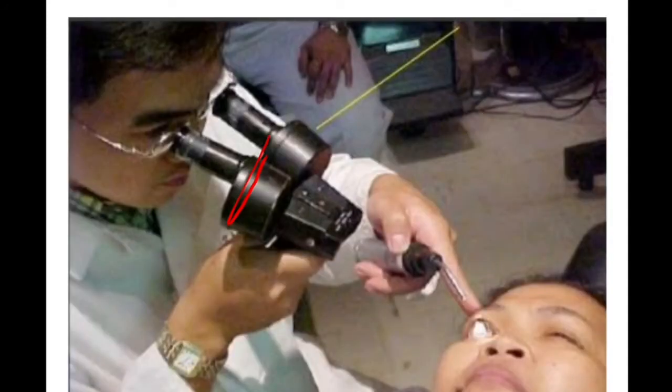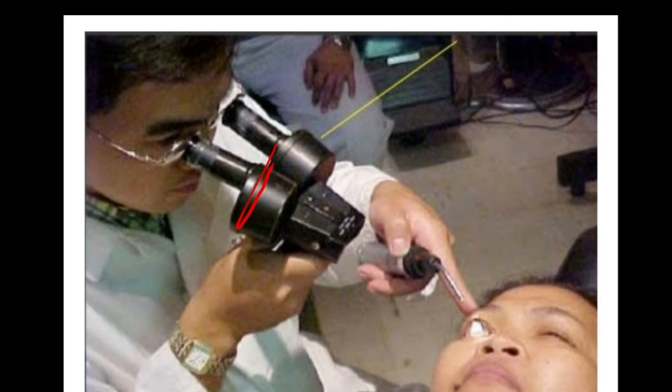Here the height of the observer may be changed to look deeper into a narrow angle. It causes less distortion of the angle. We will be measuring the true depth of the anterior chamber. It can be used in sedated or anesthetized patients. It can be used to examine the angle structures in children under anesthesia.